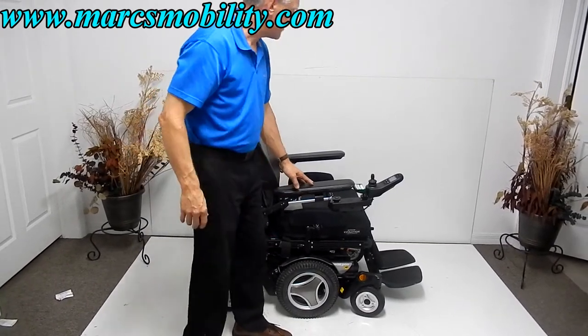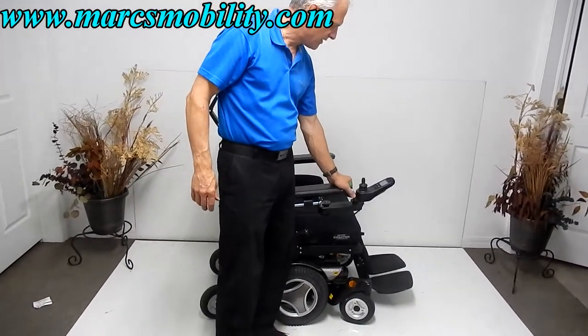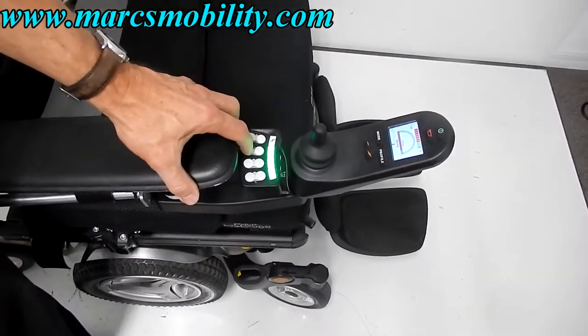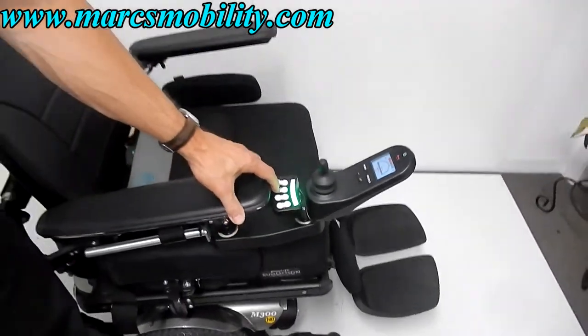The first thing I want to show you is how to work the tilt. You can work the tilt from back here or through the joystick. If you work it from back here, just push the button and the tilt will start going back. This is your tilt going back.